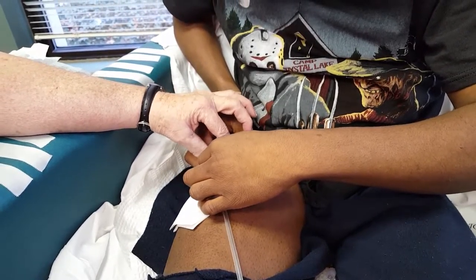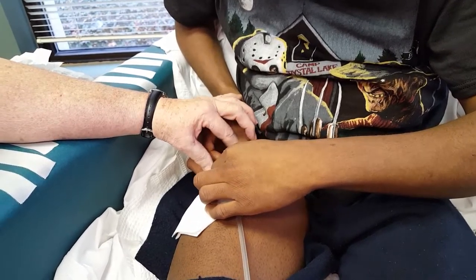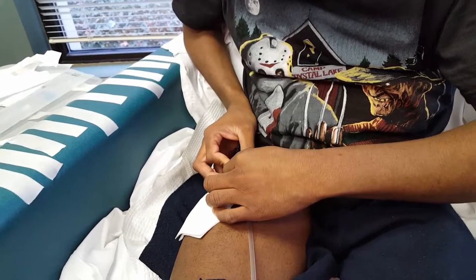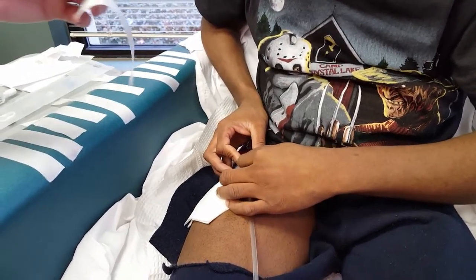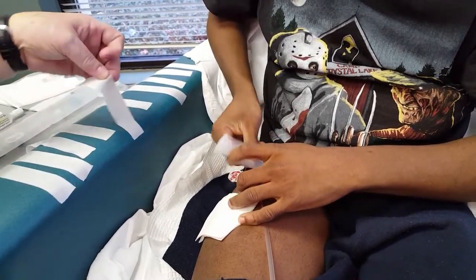You have to raise it up. Raise your needle up and then go into it. And then down. There we go. Okay, now just butterfly it in. You did good. And then here's this tape. Then I tape it so the needle will not come out.